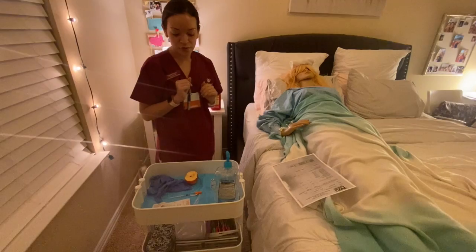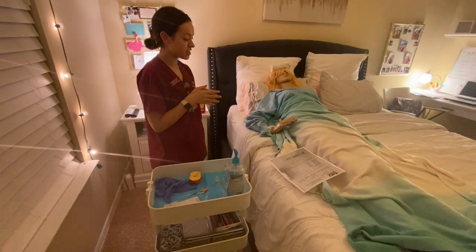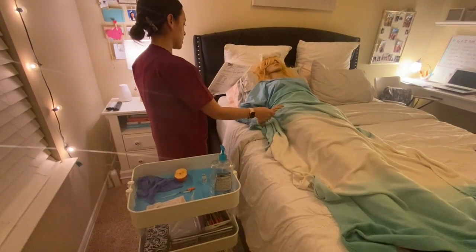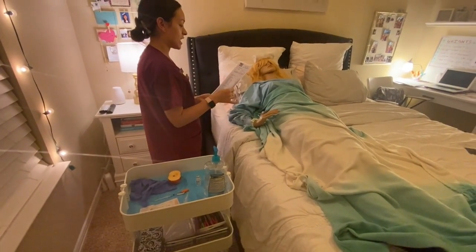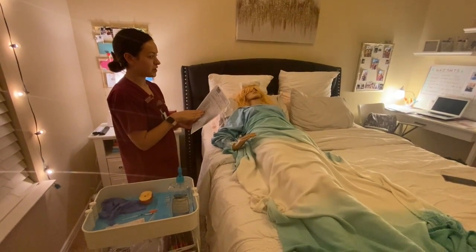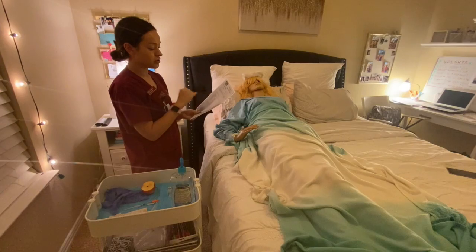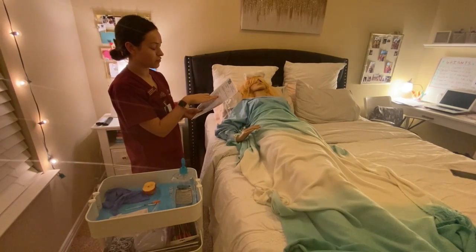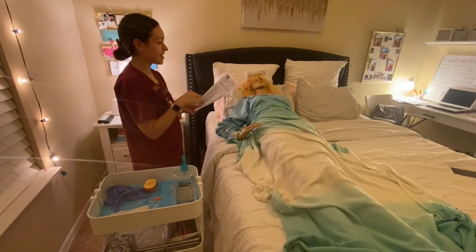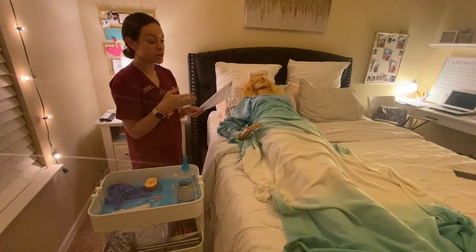So now I'm going to perform my 6 rights before I actually administer my insulin. So this is Mrs. Gwen Winthrop, and she's born February 10th, 1942. She has no known allergies, and this is the correct medication. She is getting her morning insulin of regular and NPH, 30 units of NPH and 4 units of regular. So it is the correct dose and it is the correct route, subcutaneously, and it is the right time to do so in the morning. And I will document this when I am done.